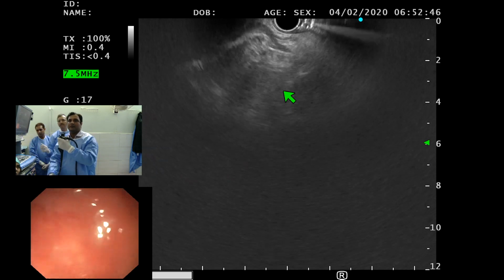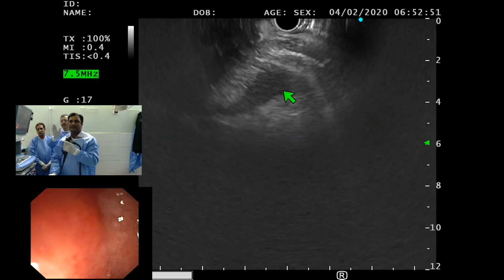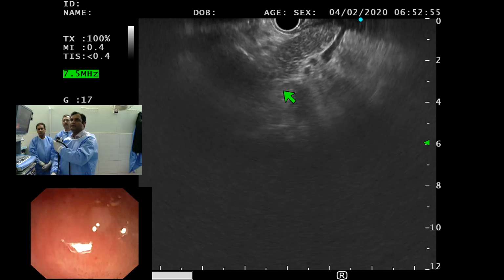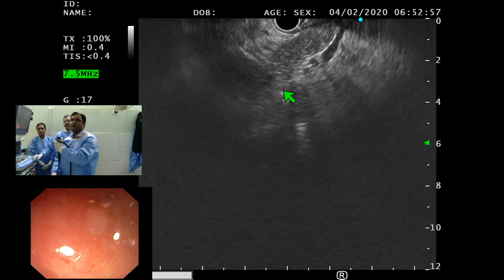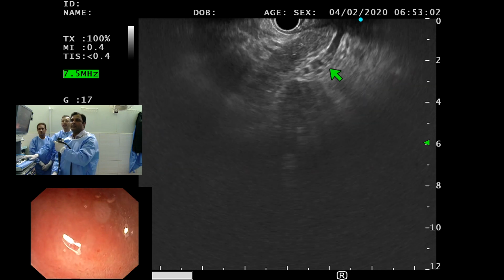थोड़ा सा और ये. ये कोई और vessels है. This way. Okay. We are straight on to the pancreas. Yes. You can see it's the pancreas. These are okay, fine.